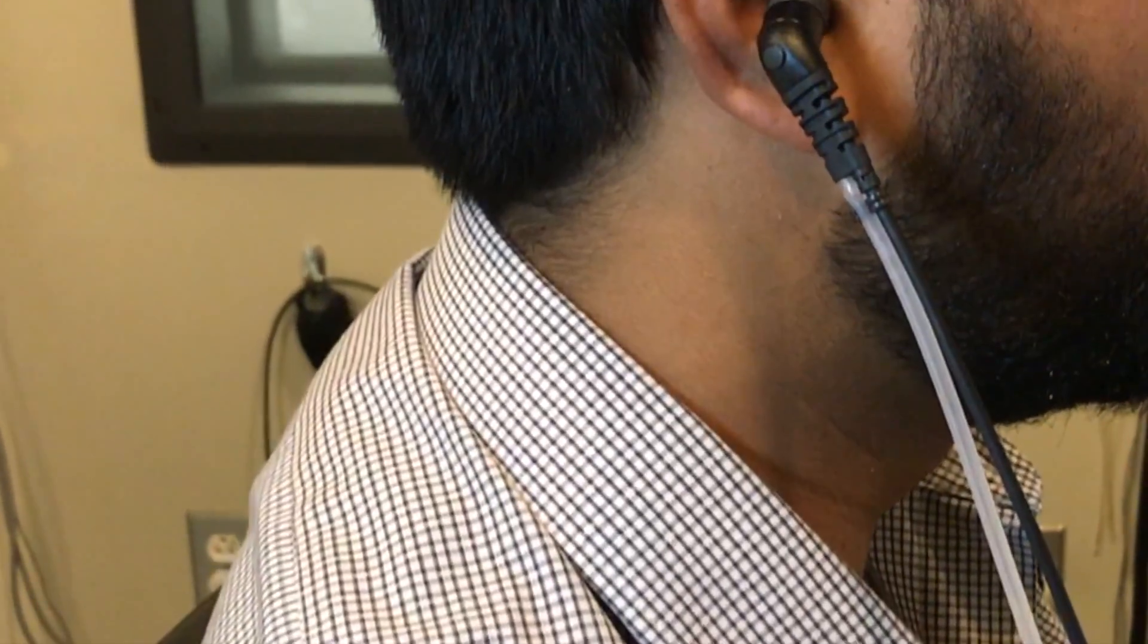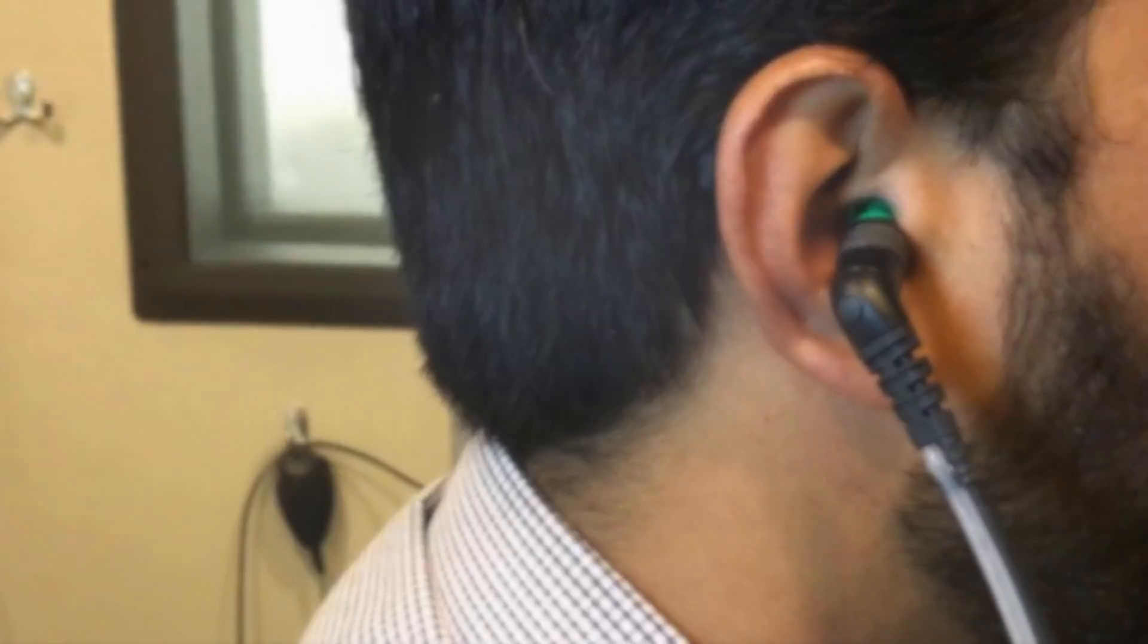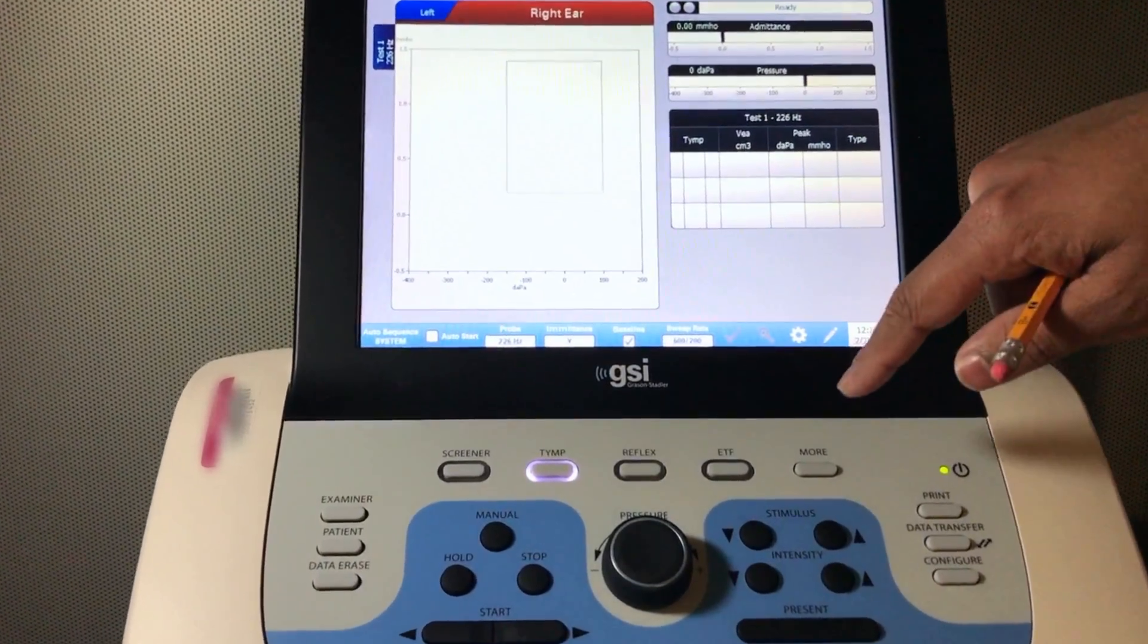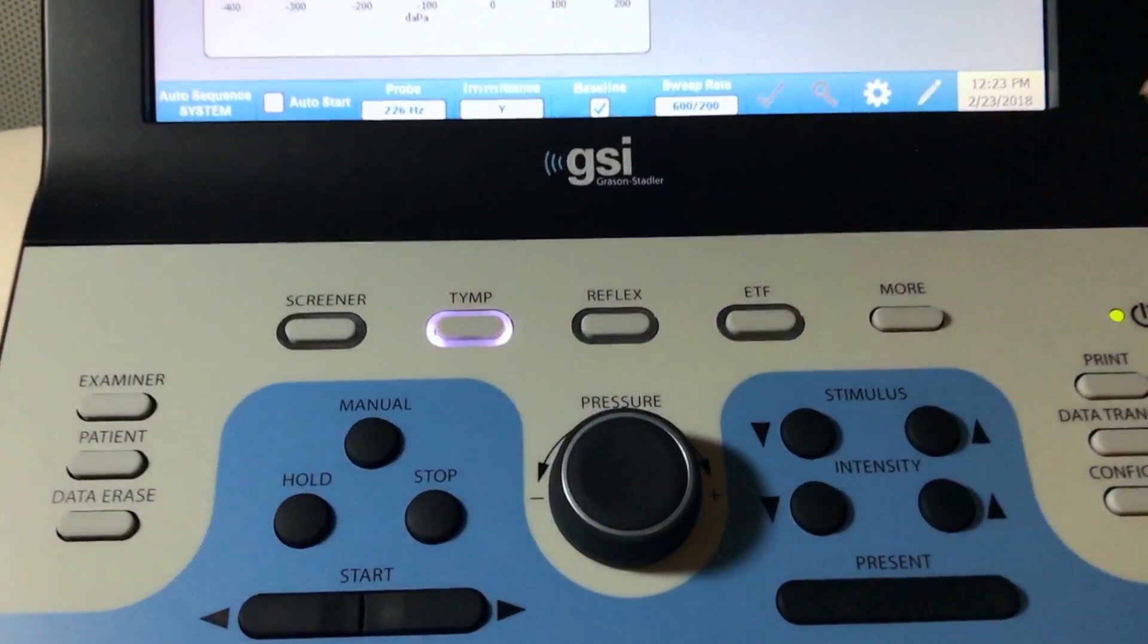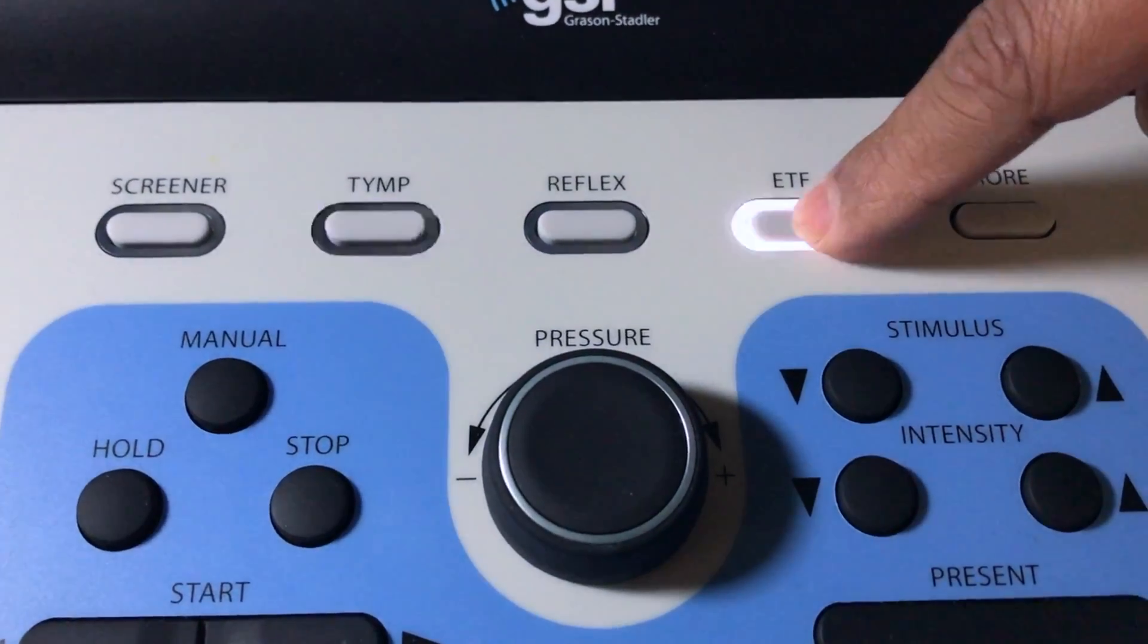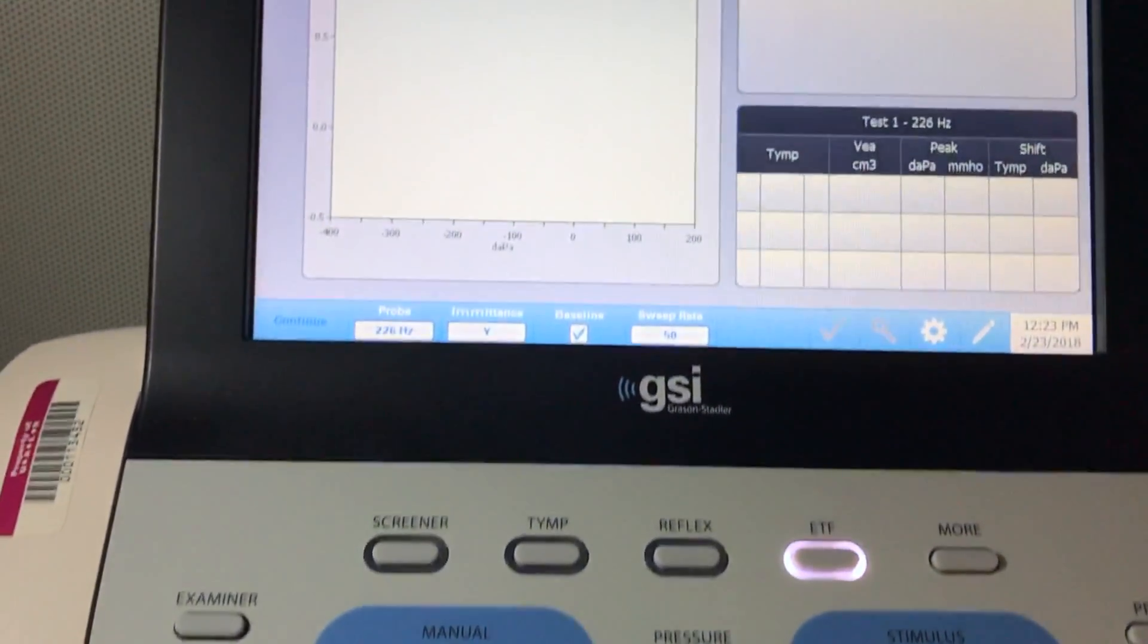Today we're going to learn how to perform the eustachian tube function test. In order to perform this test, we have a special function in our tympanometer which is called the ETF function. So select the ETF test.